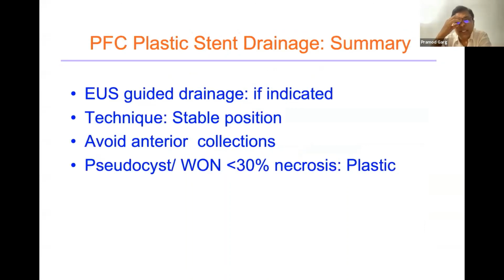So, ladies and gentlemen, I'd like to summarize by saying that in pancreatic fluid collections, EUS guided drainage is the preferred if it is indicated. We should try and avoid anteriorly placed collections. In the technique, I think most of you know about technique. The only thing I would emphasize is once you have punctured the cyst, don't move at all. Don't move yourself, don't move your scope till you have dilated the tract.